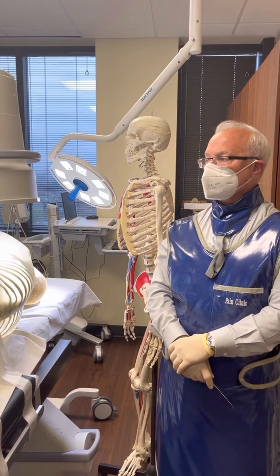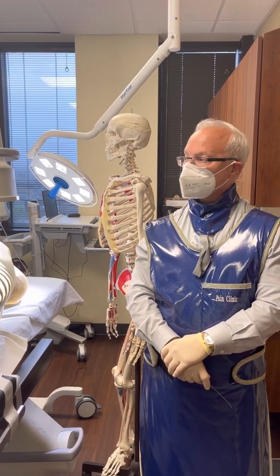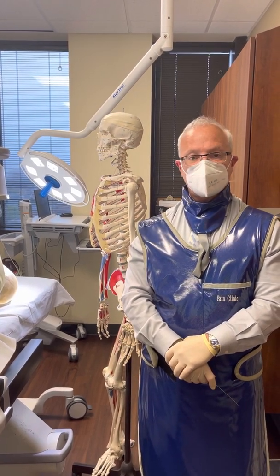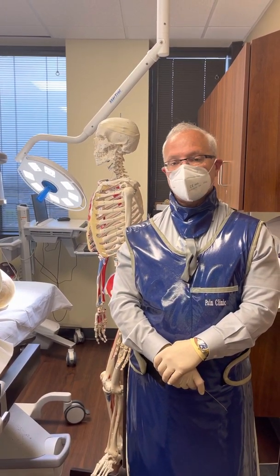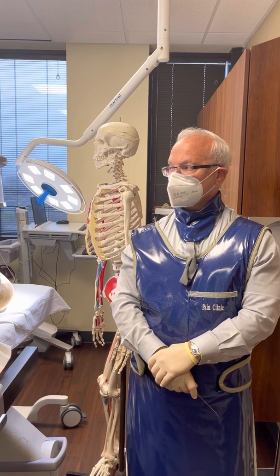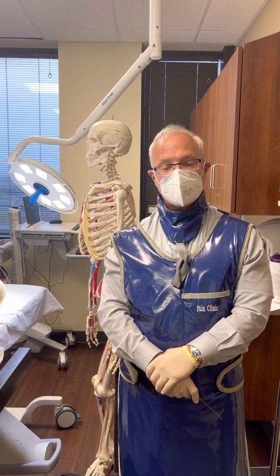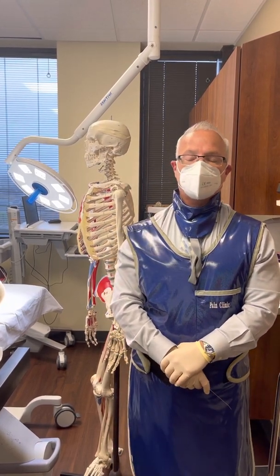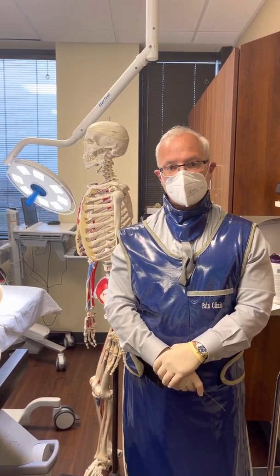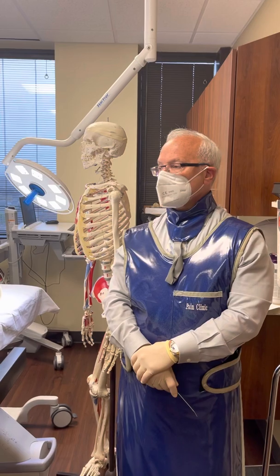Essentially, the goal is to perform an injection in the cephalad and posterior part of the neural foramen, much as one might do if they were doing a selective nerve root block. If we're going to be performing pulsed radiofrequency neurotomy, or neurotomy using continual energy with heat liberation, we would use sensory and motor stimulation. Sensory stimulation is exclusively important for the nerve at C2 because there is no significant motor component. But from C3 to C8, we would be performing both sensory as well as motor stimulation to assure that we are in the appropriate anatomical location and not engendering movement of the shoulder or the upper extremity on the ipsilateral side.